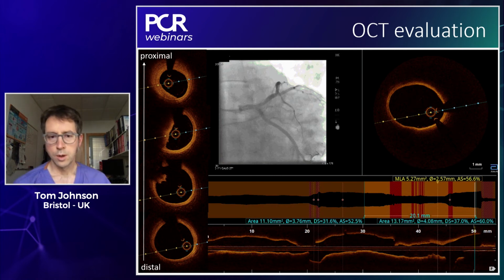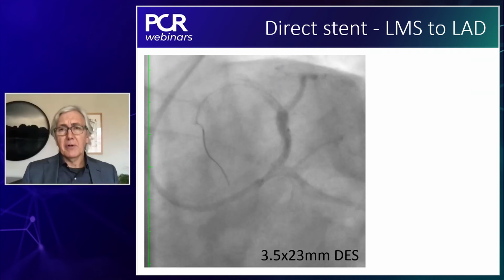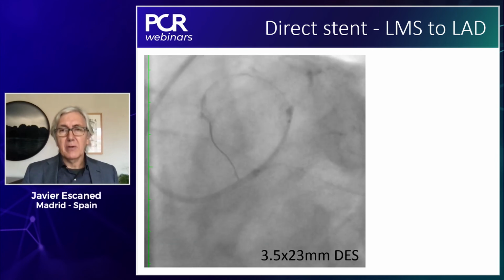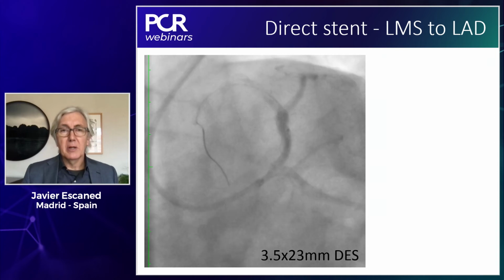I think that's what you're saying is extremely important, and the fear of avoidance, nailing the ostial LAD, which, as you say, is not working. The fear that you are embarking into treating or stenting up to the left main.